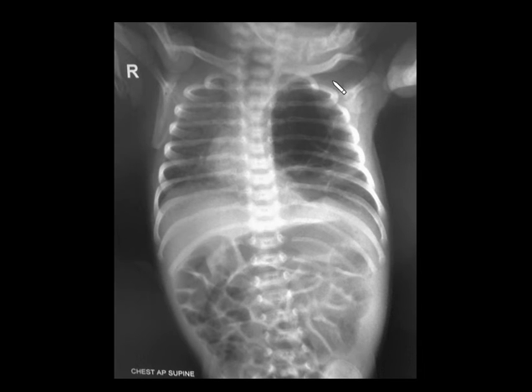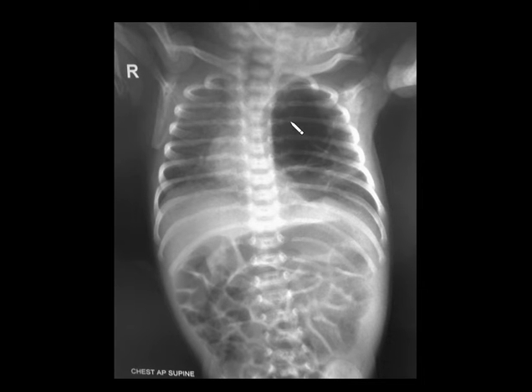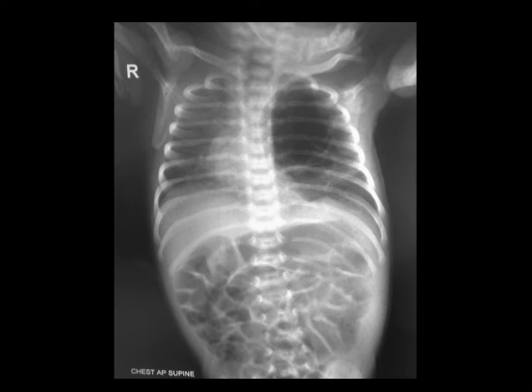Coming to the next spotter, you can see there is a hyperinflated, hyperlucent lung in the left upper and mid zones. No cystic and solid components are noted within the lesion, and there is shift of the mediastinum to the right side. This is a case of congenital lobar overinflation (CLO), previously called congenital lobar emphysema.